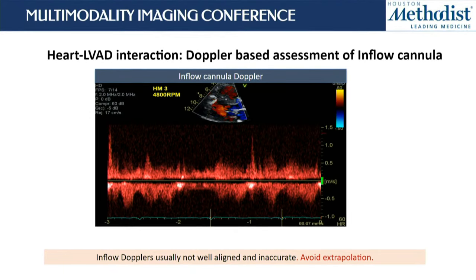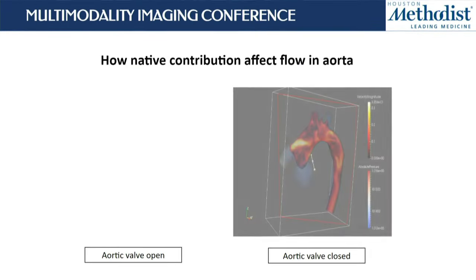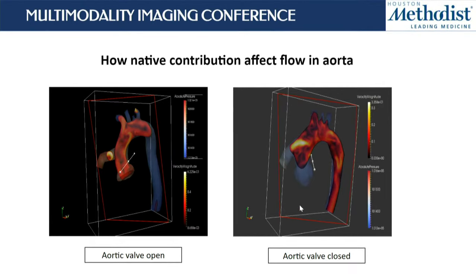Unfortunately, with how our anatomy is, we've not developed a good way of really getting aligned with the inflow cannula properly. And this is not something that Dr. Yousafzai and I talk about in terms of patients. Oh, the velocity was higher, so we need to do something about it. Really, we don't pay much attention to the inflow cannula velocity because we don't trust it. This is just an assessment of what cardiac output looks like.